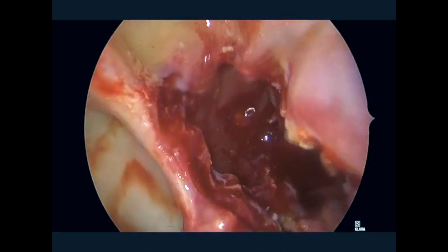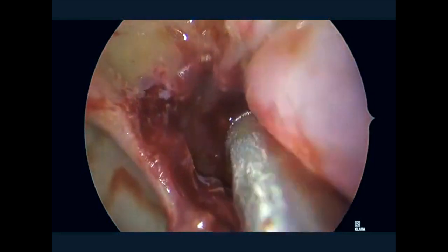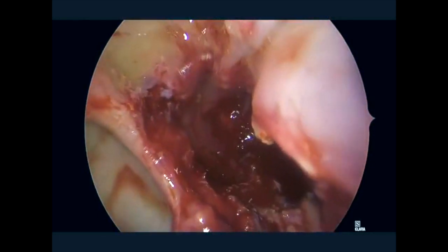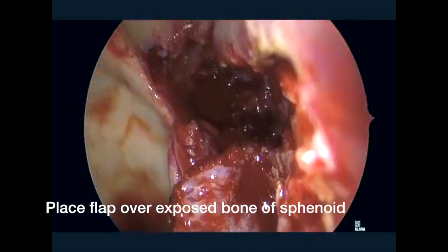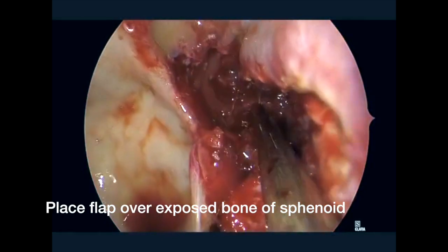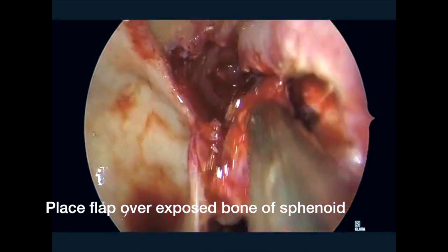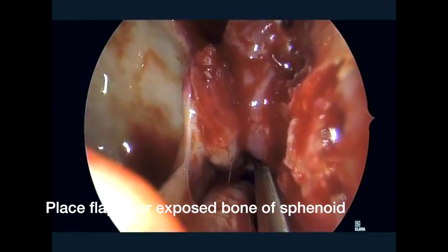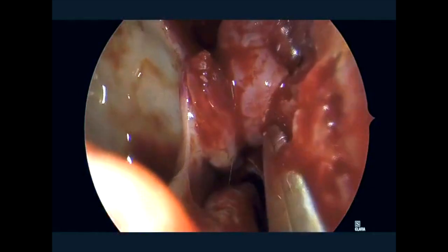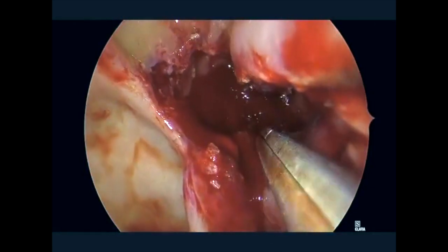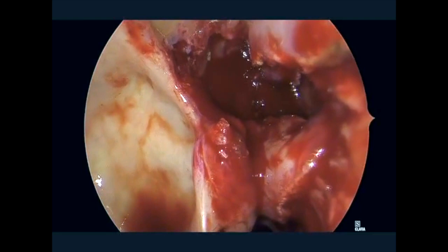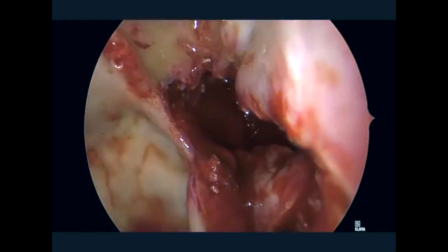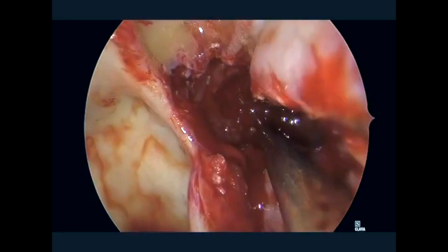Now we have a wider common cavity between the left and right sphenoids, preserving the superior mucosa on the septum with the olfactory fila and epithelium. Once that's accomplished, we rotate this flap into place, bringing it superiorly and then across the sphenoid opening in order to provide good mucosal coverage of that osteitic bone of the sphenoid rostrum that was drilled down.